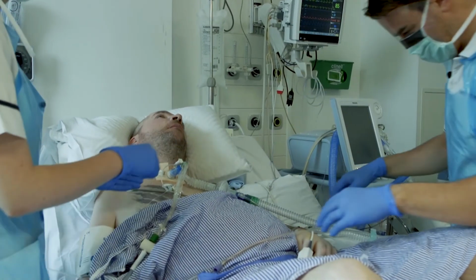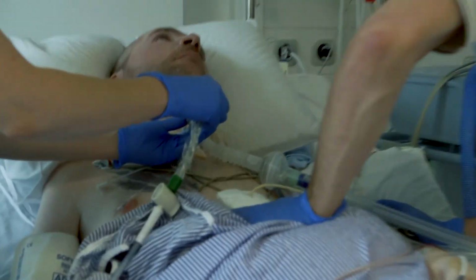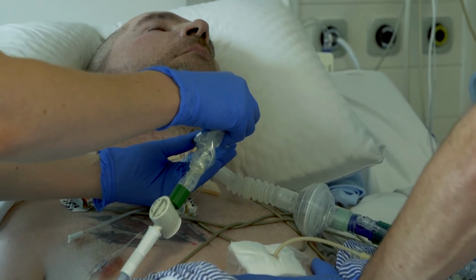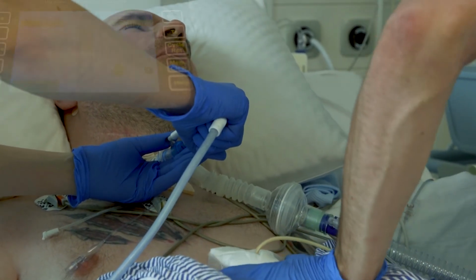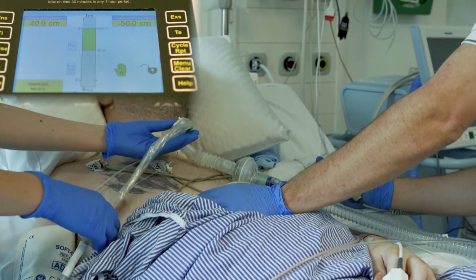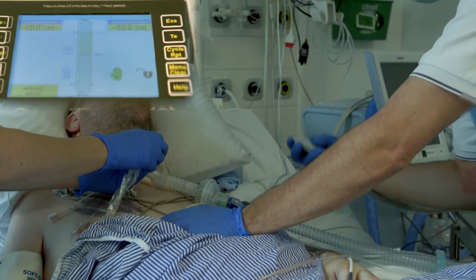So that's on, okay. So, breath in and out. Breath in and out. Okay, and breath in, feeding down, and cough, and suction out, cough, cough, cough. Well done, really good. A couple of breaths at the end. Got any more, Alan? One more. Okay, we'll do one more cycle.